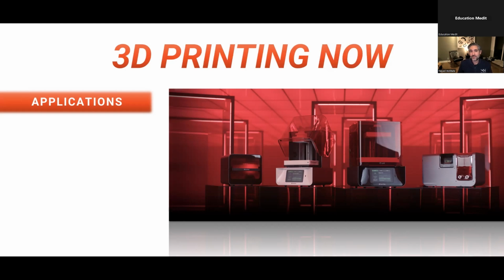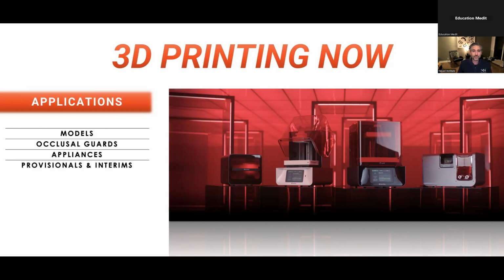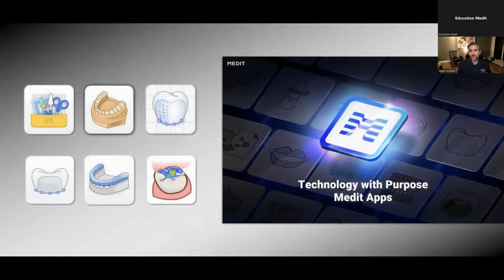And fast forward to today, and all of a sudden, we have so many different options, including 3D printing models, occlusal guards, all sorts of different appliances, provisionals and interim restorations, and now even final restorations. So 3D printing and intraoral scanning have really come together to provide so many different applications.